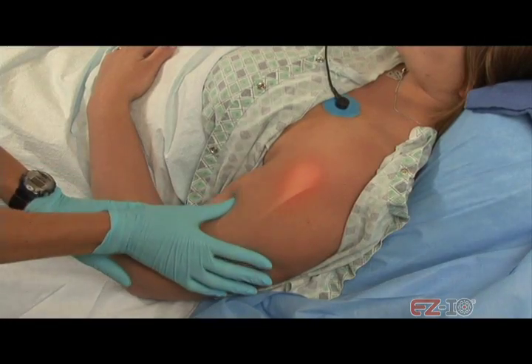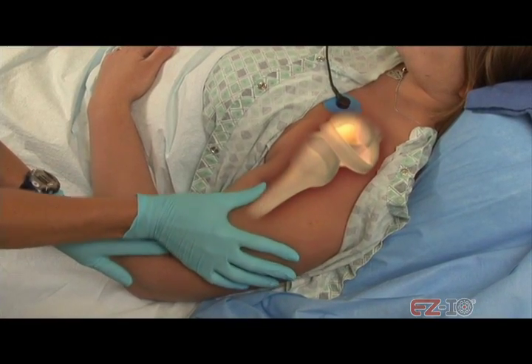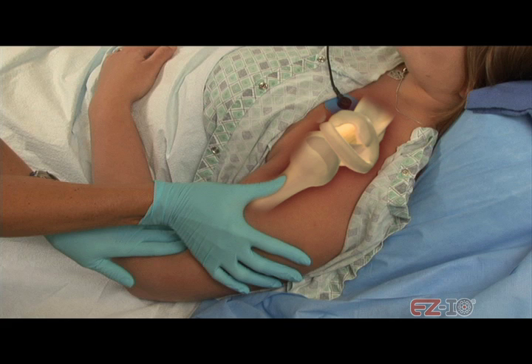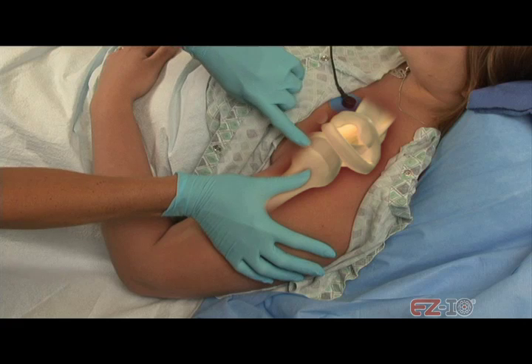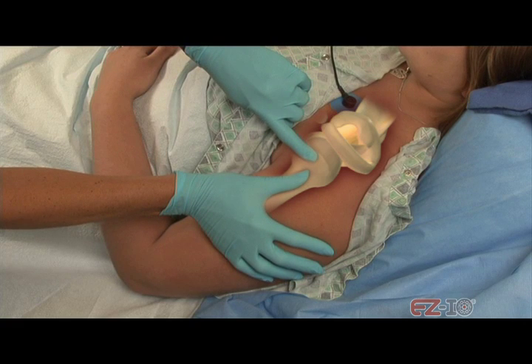Next, identify the site. The proximal humerus insertion site is located directly on the most prominent aspect of the greater tubercle. Ensure that the patient's hand is resting on the abdomen and that the elbow is adducted or close to the body. Slide your thumb up the anterior shaft of the humerus until you feel the greater tubercle. This is the surgical neck. Depending on patient anatomy, approximately 1 centimeter above the surgical neck is the insertion site.